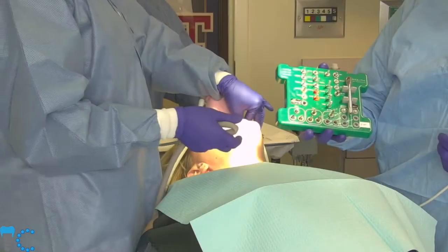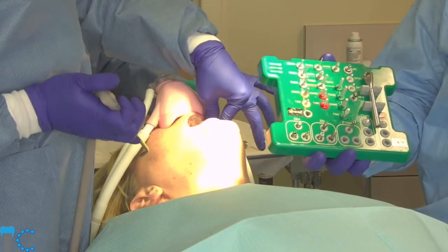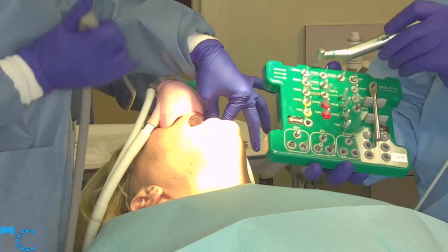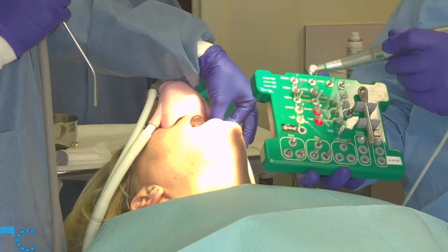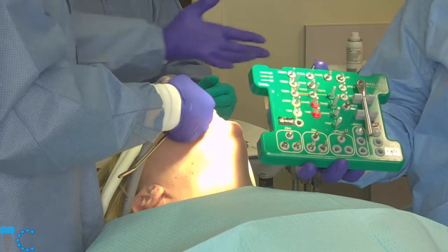Right, cool. And so this is the Z Systems kit? Yep. Here's their surgical kit. And they start off with a round burr, which usually I kind of skip the round burr. If we follow the yellow line, that's the drilling sequence for a 3.6 millimeter diameter implant.